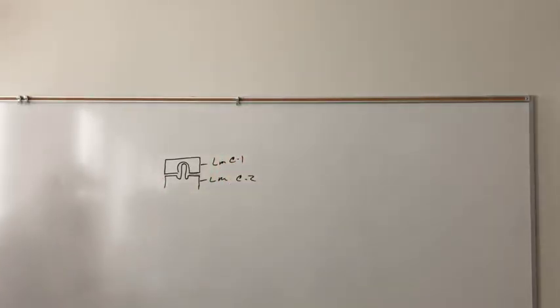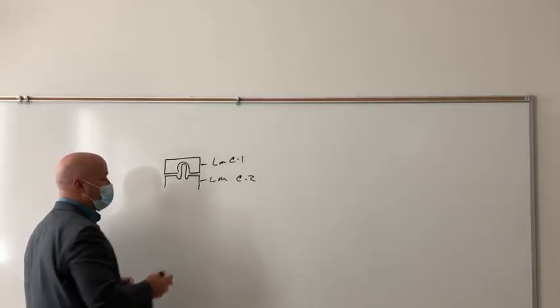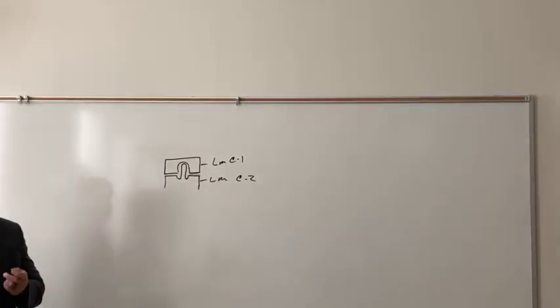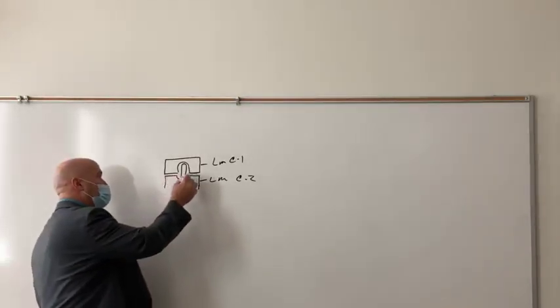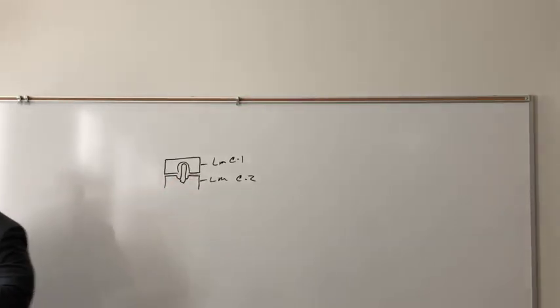So your odontoid process should look something roughly like that. And what we're looking to see in the open mouth odontoid is a number of different things. One is a broken odontoid process. If we've got a broken odontoid, most of the time it's going to break at the base of the odontoid and possibly down into the body of the odontoid.